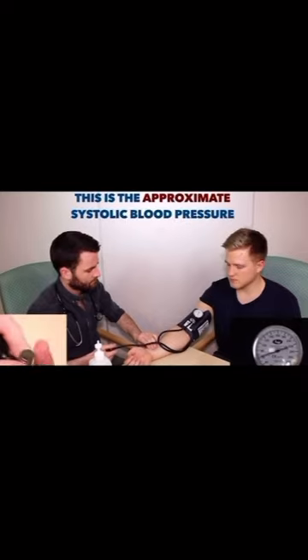Note the reading on the sphygmomanometer at the point at which the radial pulse becomes impalpable. This reading is an approximate estimate of the patient's systolic blood pressure. Deflate the cuff. Close the valve on the blood pressure cuff.